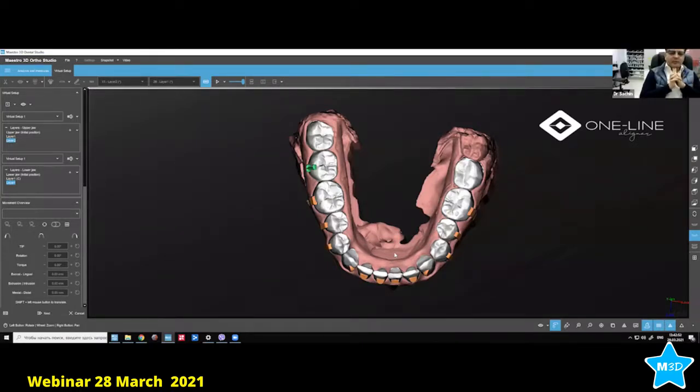Yeah, this is a good question. So before I was using a different kind of sheets. I was using single layer sheets before, which was Taglus, and I was using American Orthodontics. Then I was using also Biopril, it's also single layer, and I was using Duran also, which is also single layer. So with single layer, yes, you might be needing different thickness of sheets.